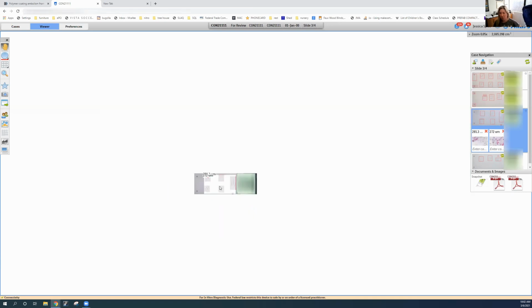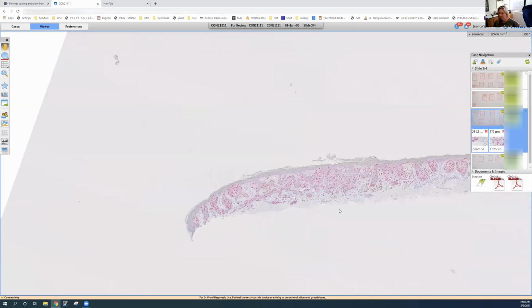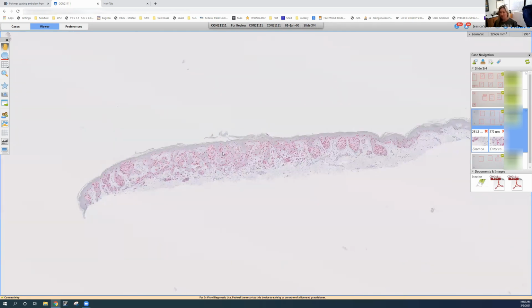And PRAME is a new antibody that we're using in our lab that stands for Preferentially Expressed Antigen in Melanoma. It's an acronym. And it's a melanoma-associated antigen that was isolated by autologous T cells in a melanoma patient at Memorial Sloan Kettering. It was recently introduced to the dermatopathology community by Klaus Busam, who's the dermatopathologist at MSK.